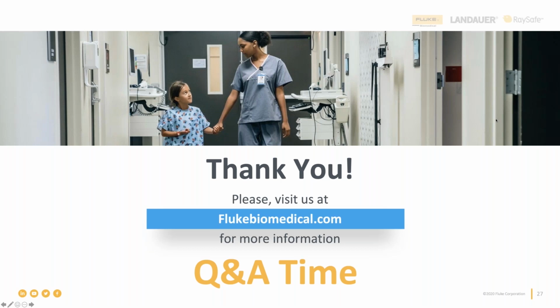So we touched on heart rate in a few parameters, and I just want to call that out. So ECG, it's a waveform, right? With each pulse of the heart, you're getting a measurement off of the electrode, and you're seeing that. So the heart rate on an ECG is measured peak to peak, right? So that's how ECG is measuring it. We also talked about SpO2, and one measure there is pulse rate, right? It was measuring the pulses of oxygenated blood from the heart. So that's another measure of heart rate.